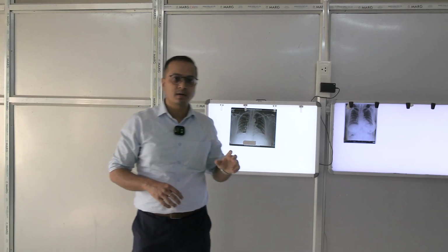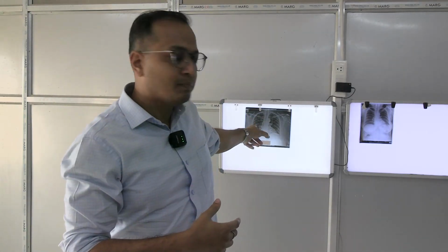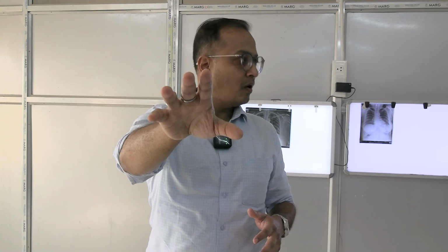We have a reason for doing this. What do we mean by the posterior anterior view? Assume this screen you are seeing is the light source, and I am standing in front of it in normal anatomical position. The light penetrates me and is captured on the film behind. This is how the projection works. If the machine is in front of me and the light is thrown from there, that makes it an anterior posterior view.